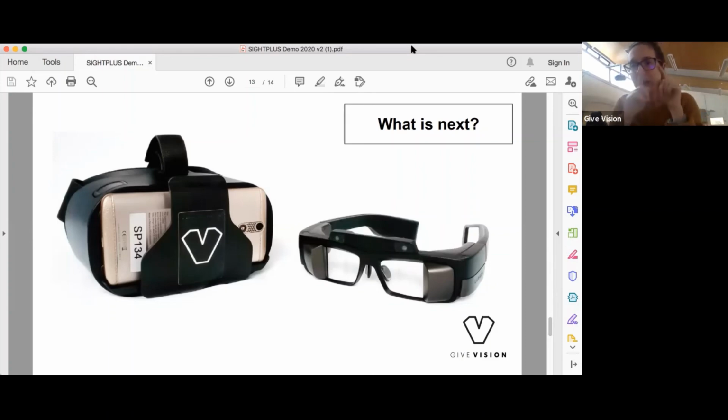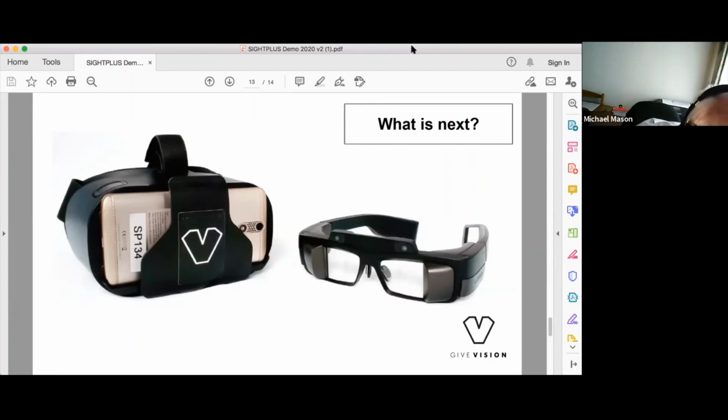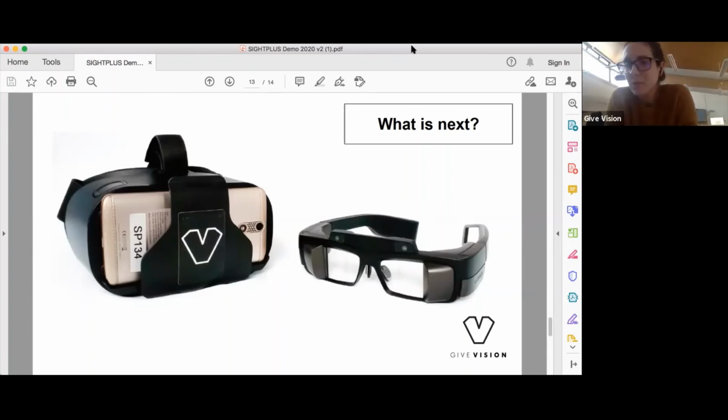It means the size of the screen. Right now the field of vision is a bit less, around 50%. But for people with central vision loss or low vision, for something to be very useful, it has to be a minimum of 70%. That's what we've learned, and we've tried different hardware. So we reached the conclusion that we might need to build our own.